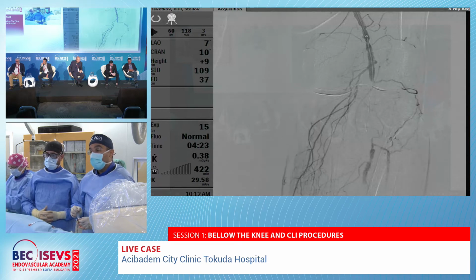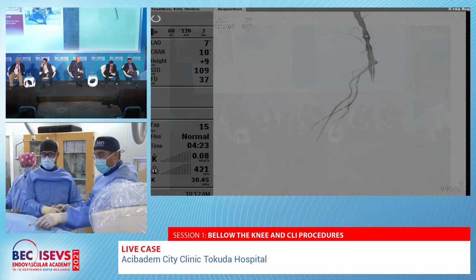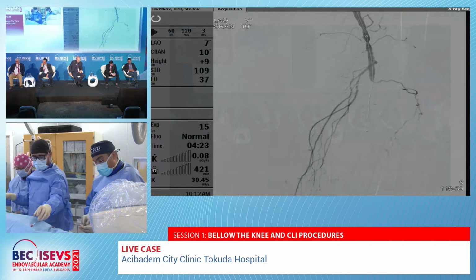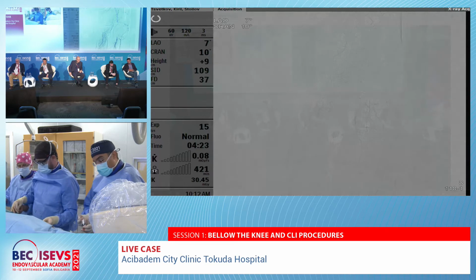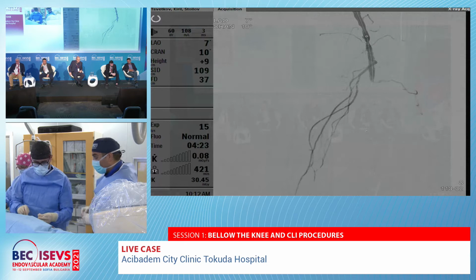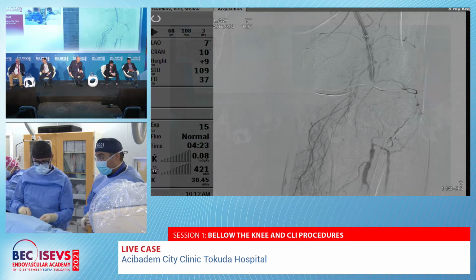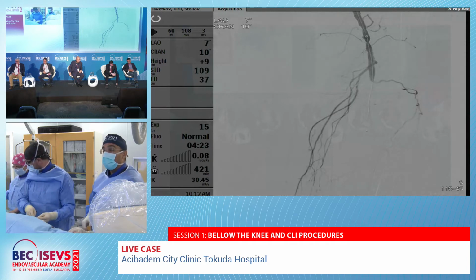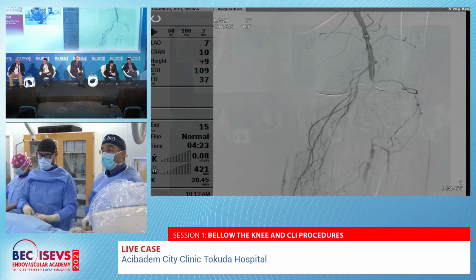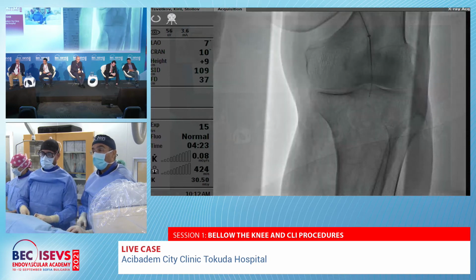Okay, we need a little bit more. Let's try further. If you don't have any backflow, don't try to do any kind of angio from the support catheter, because the contrast is staying inside the lesion. It causes only problems, and maybe you are on a dissection membrane, you may make it really more difficult. You see how it looks like. We have to further work on this.